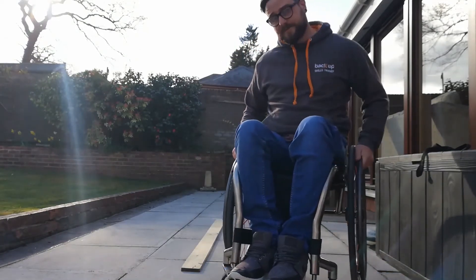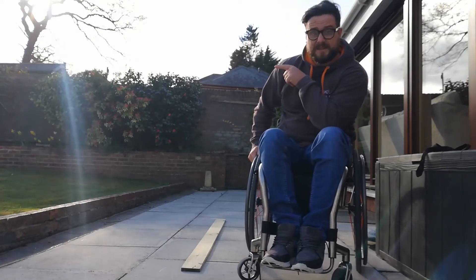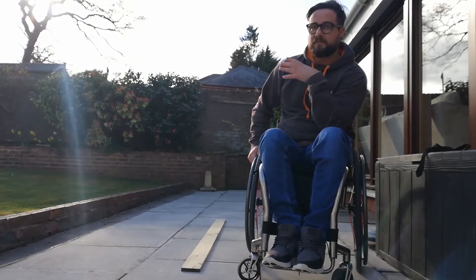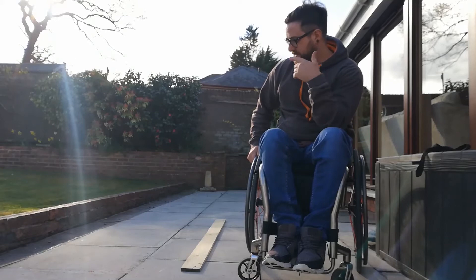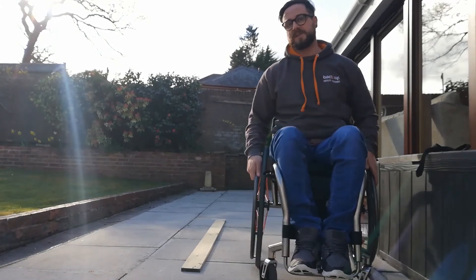Remember to keep your eyes focused on an object in the distance when back wheel balancing. Keep those shoulders nice and relaxed. Keep breathing the entire time, just staying nice and relaxed throughout — remembering everything we talked about with back wheel balance and applying these extra few steps.